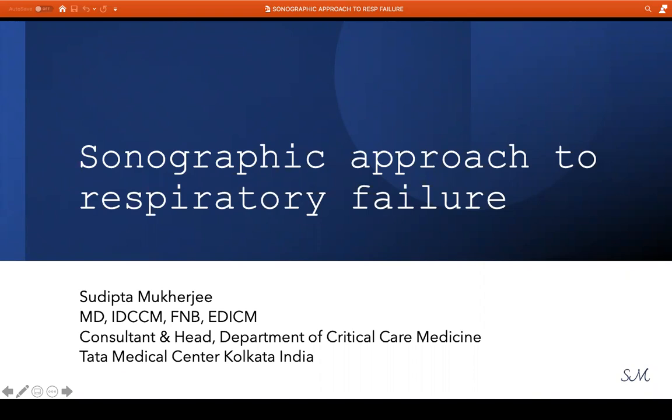Hello, everybody, and welcome to another session on point of care ultrasound for focus. And today we will discuss the sonographic approach to respiratory failure. In the next 30 minutes or so, we will see how we can use ultrasound in the diagnosis, monitoring, and management of a patient who presented with an unknown cause of respiratory failure.